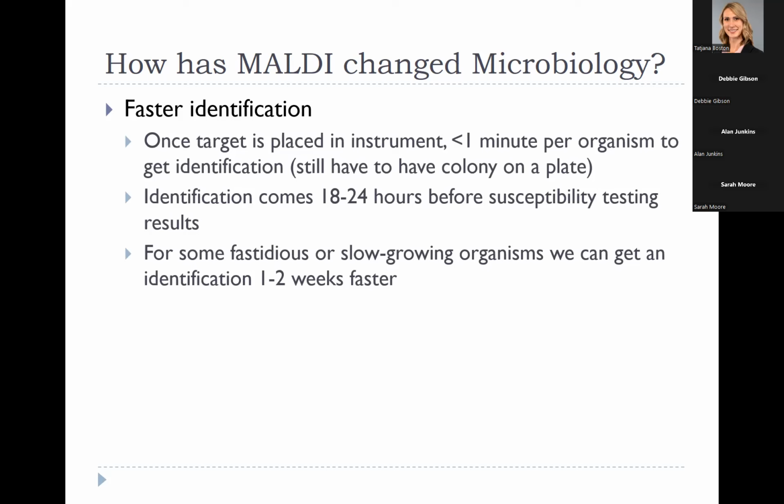Honestly, I always thought antibiograms were a little weird, a little dumb, because not many times would you walk into a doctor's office and the doctor would say, I think you have a Citrobacter freundii infection. This urine looks like Citrobacter freundii. But now that antibiogram becomes important, because we can say, look, you do have Citrobacter freundii, or you do have Klebsiella pneumo, or you do have Staph haemolyticus. Here's what our resistance pattern looks like for those organisms.